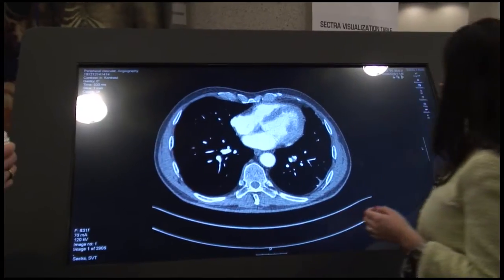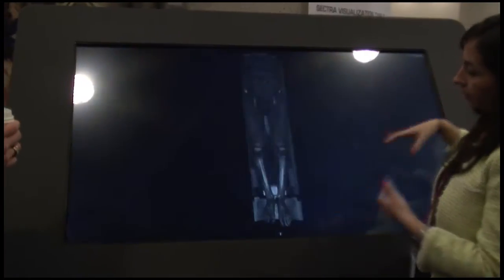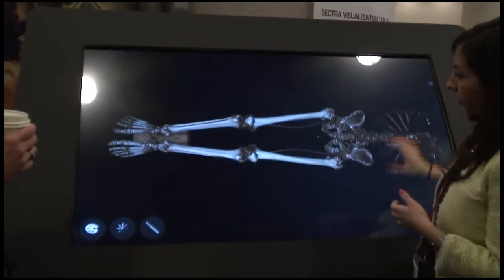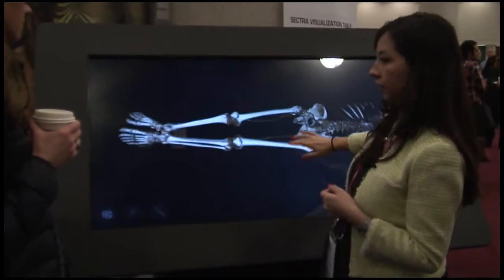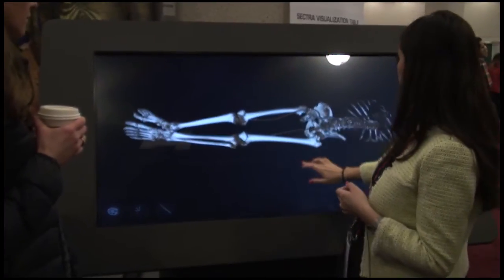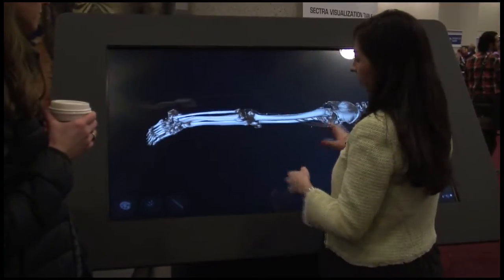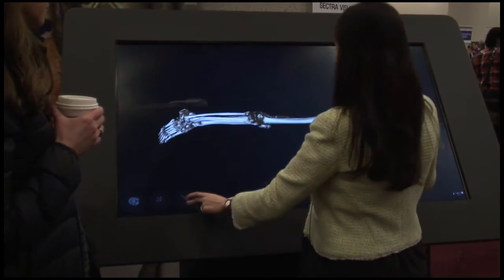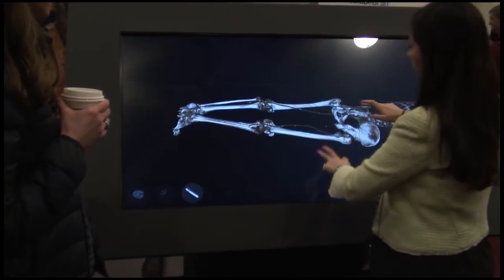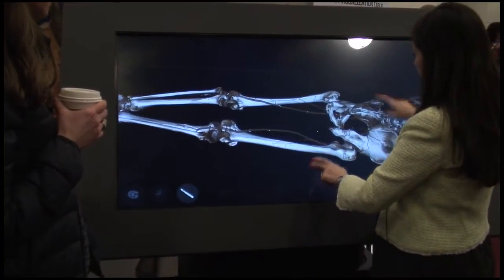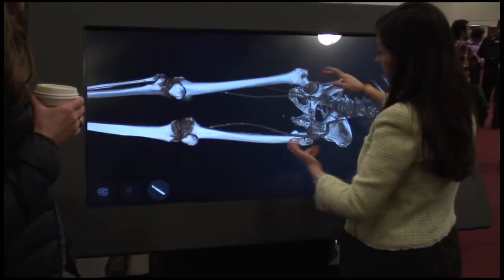Full peripheral vascular. Basically I press the 3D button and it makes a 3D rendering of the image. In this case for example I can see the CT bed, so I can delete it, remove it, and then I can see very clearly here the pelvis.